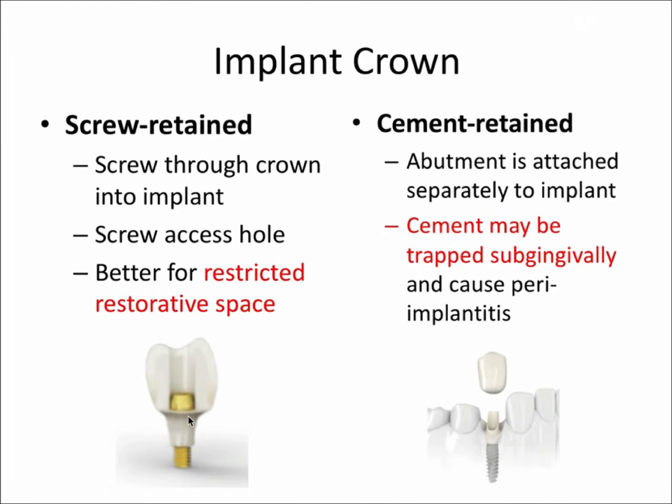So technically now we're combining the crown and the abutment components, and then the abutment screw, shown in gold here, is drilled through both of them. So this would technically be an example of a two-piece abutment, where the screw and abutment are separate. Now, the cons of this type are that we have a screw access hole.